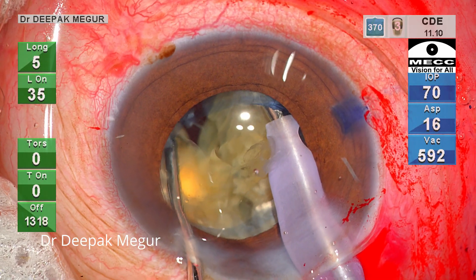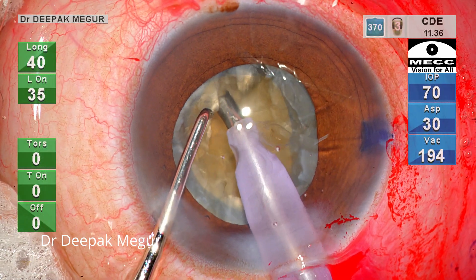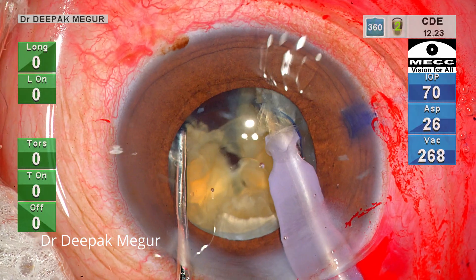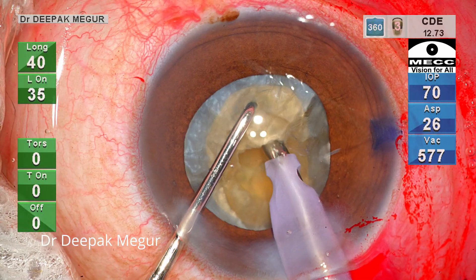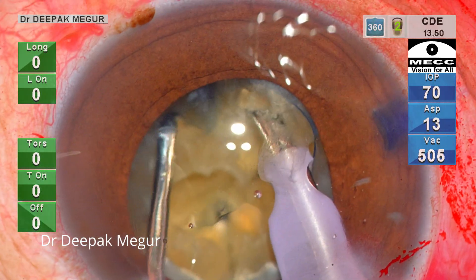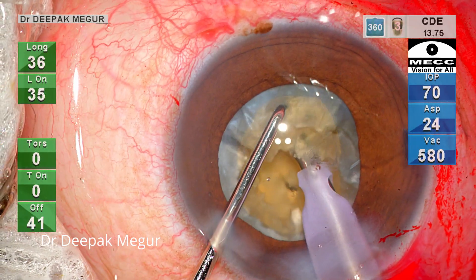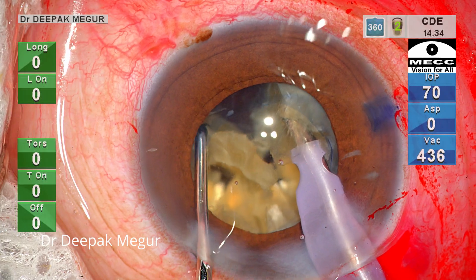It's important that the chopper is kept at progressively deeper planes and then only a little lateral separation is needed. In the initial part the posterior plate was not cracking, but progressively as we continue with chopping, we can see that without inducing much stress on the rhexis margin, we could achieve successful division of all fragments including the posterior plate. Six small fragments are now free, and this was achieved because the chopper was placed at subsequently deeper planes.